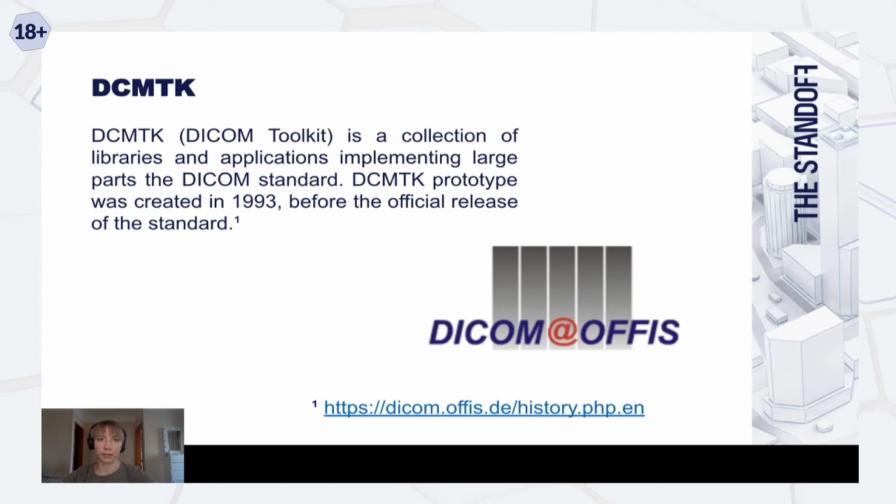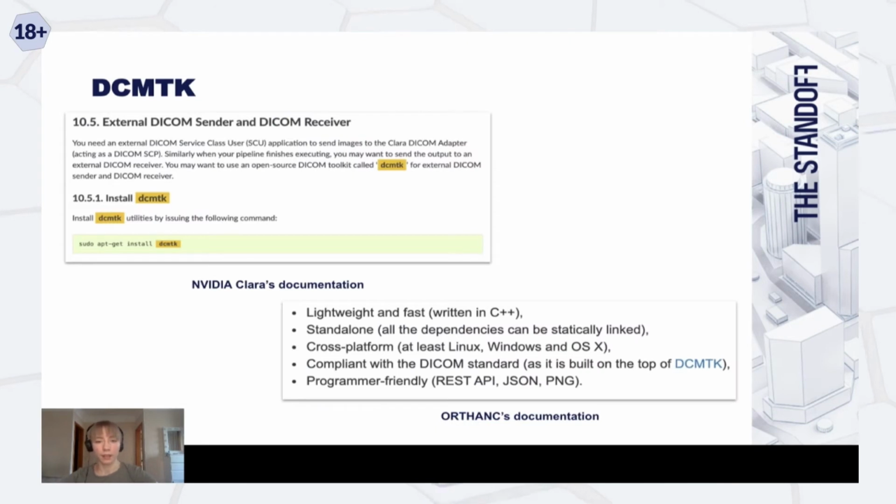For example, SimpleITK and CMTK use it as the prototype. They think that this should work just like DCMTK. DCMTK is recommended when you create your own pipelines for training your network to work with medical images, and the DICOM server from this particular toolkit is used here.